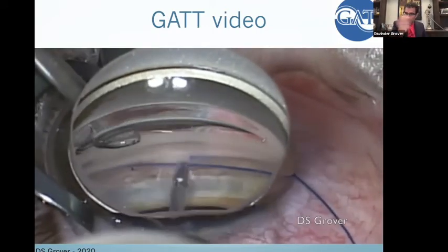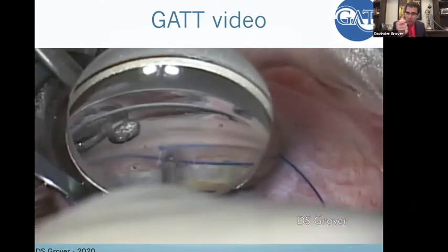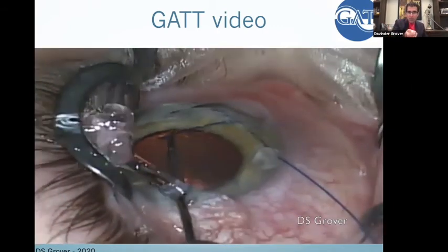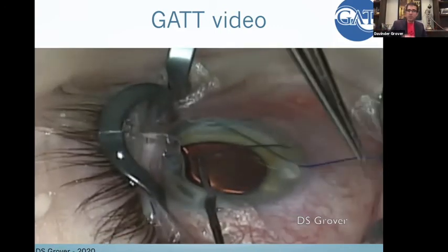If you keep pushing like this, you don't feel a resistance, you're in the wrong space. But if you push and you feel the resistance, you want to feel it, and then you pull out, I hold it here, and then I externalize. You get that circumferential anterior cleavage.